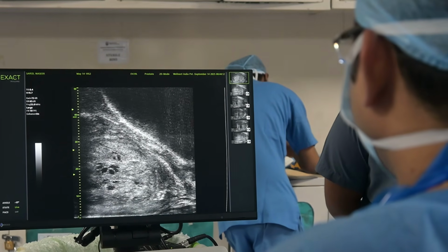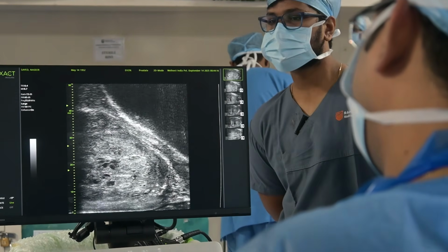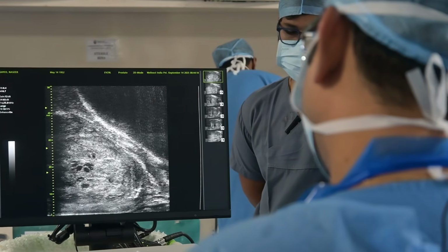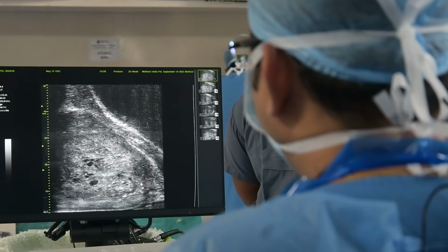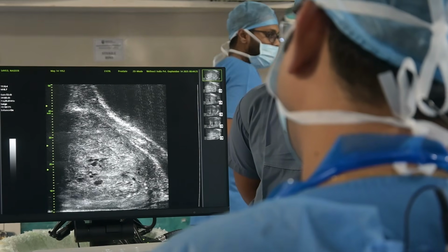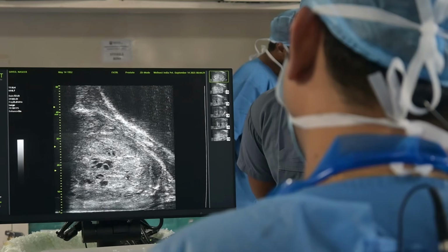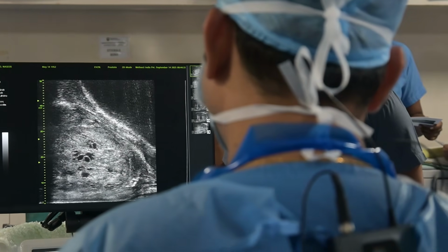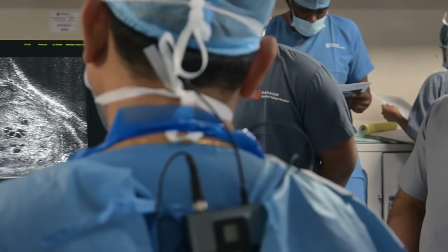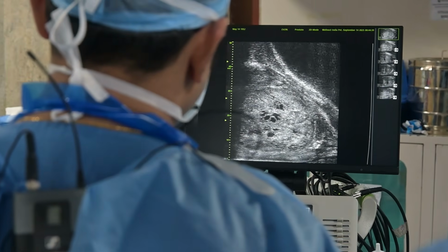Now micro ultrasound has a grading of its own, and like PI-RADS grading, this grading is called the PRIMUS grading from 1 to 5. It works on a similar principle: grades 1 and 2 are totally benign and 3 to 5 merit a biopsy, and 3 is equivocal. So what we are seeing on the apex at this point is between 3 and 4. The starry sky is clearly PRIMUS 4. Okay, sir? I am going to put a target here, a targeted biopsy here.